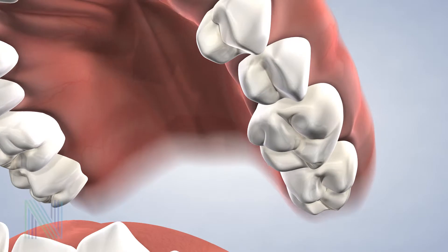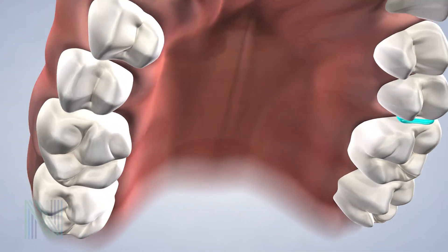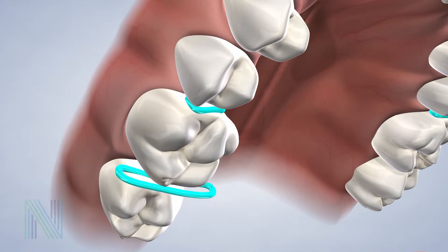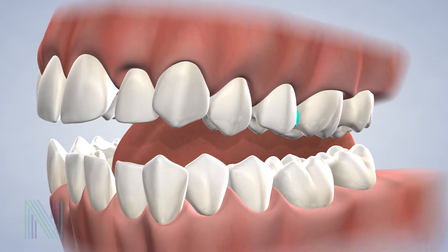To place the spacer, we stretch out the small band and thread it between the teeth, similar to the way that you use dental floss. It is normal to feel a little bit of pressure when the spacer is placed, or soreness as the teeth begin to move. Most patients say it feels like they have food stuck between their teeth.